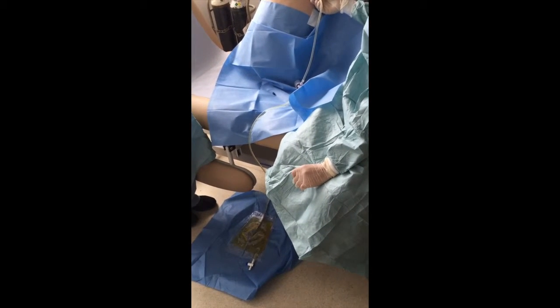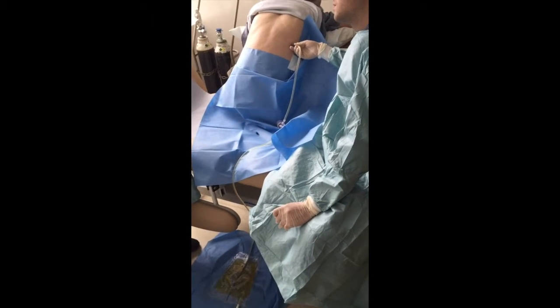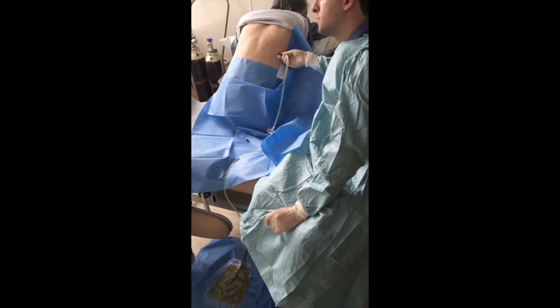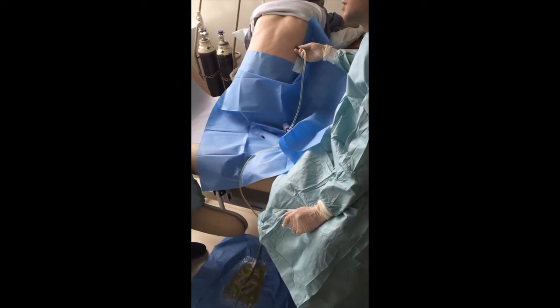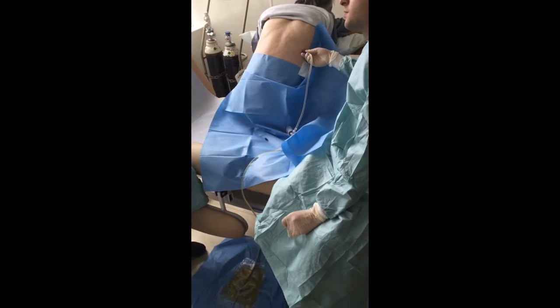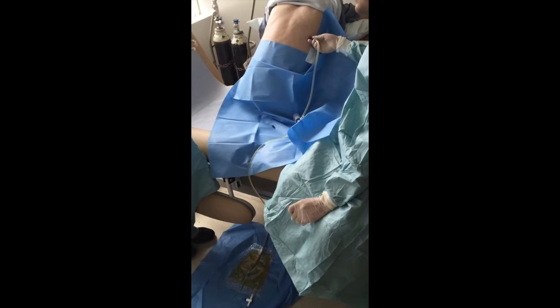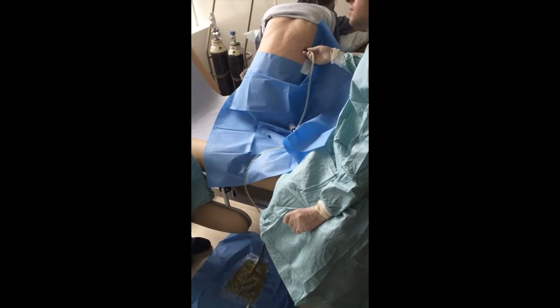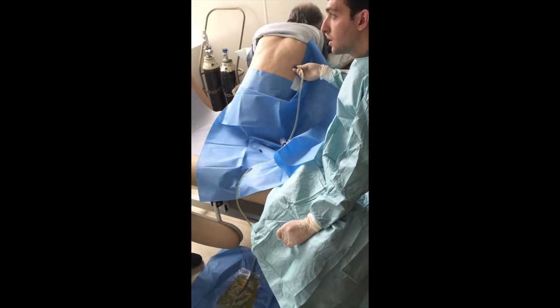Okay. Do you know what the other risks of draining too much fluid off in one go are? Since the blood pressure might. Yeah, so the blood pressure could drop down, but sort of the main thing really is the risk of re-expansion pulmonary edema. Okay. So especially with a cardiac patient who's got cardiac history, you just need to err on the side of caution. You might need to take a smaller amount of fluid off. Okay. But that's all draining away nicely there.